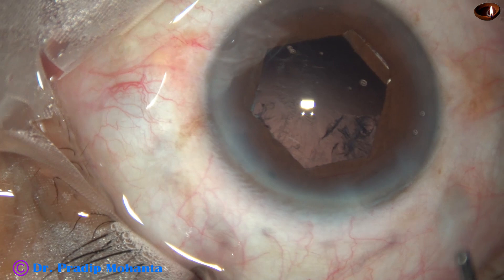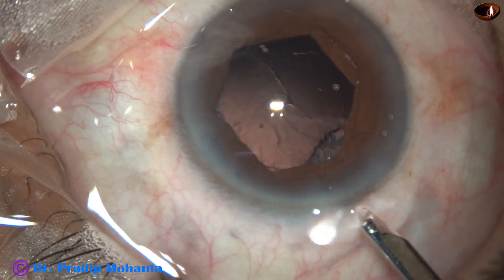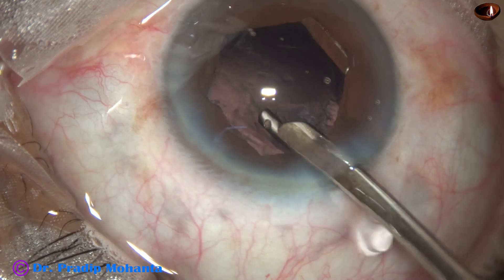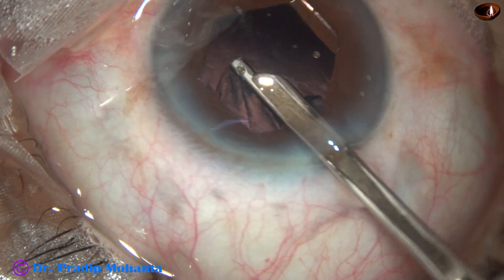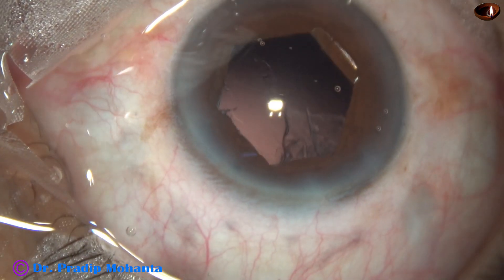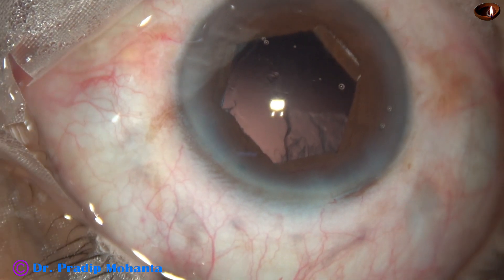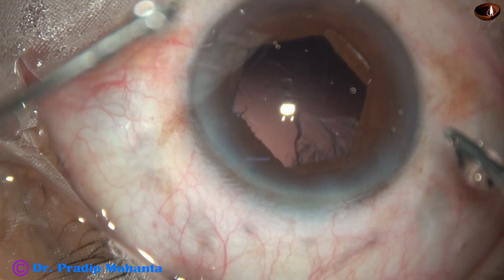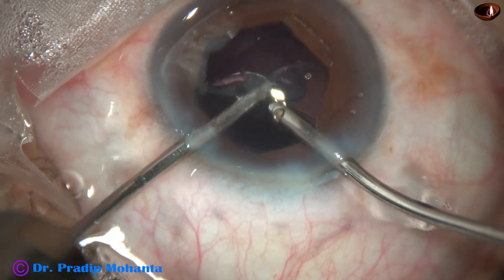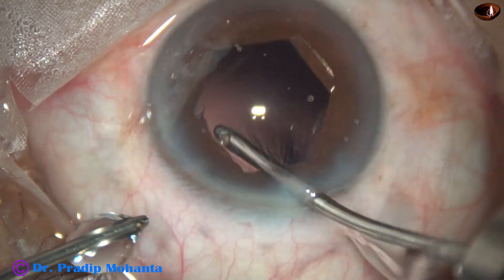There is some amount of cortex remaining. Visco is injected, and I go with the Simcoe cannula to remove some cortex. By this time, the bimanual IA is getting ready. The sub-incisional cortex will be removed by bimanual irrigation aspiration. I have only one side port, so I am using the irrigation through the main port. I elevate the anterior wall of the main wound, and enough depth of anterior chamber is achieved for removal of the sub-incisional cortex.